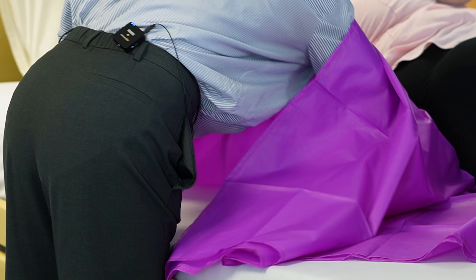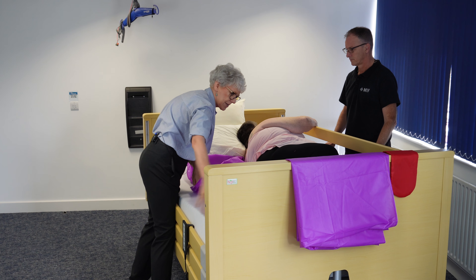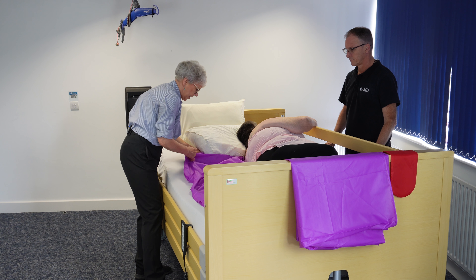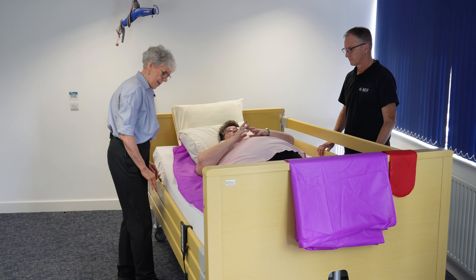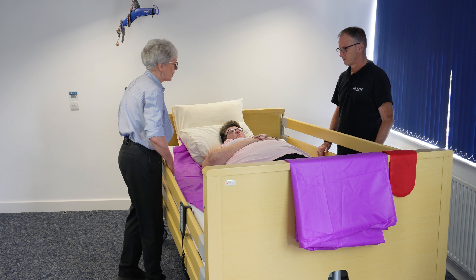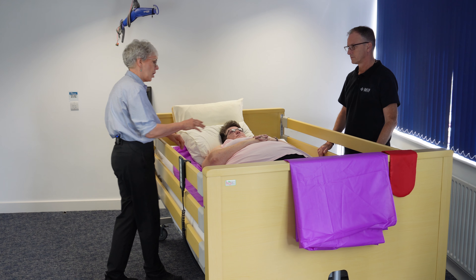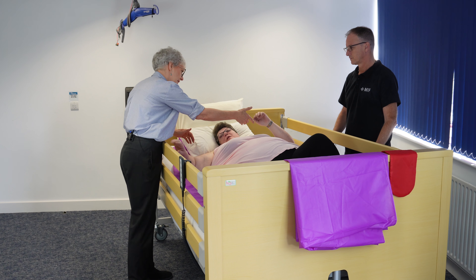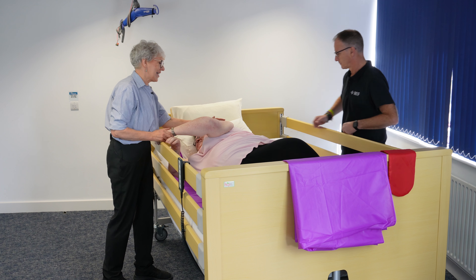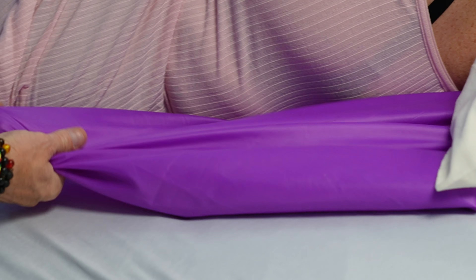I'm just going to come back down and under. I'll make sure that's smooth underneath. If you'd like to come back onto your back, Lou. At this point I'm going to ask Chris to uncurl — if I bring the bed rail up it just means that Lou's got something to hold on to, so if you'd like to come over and hold on to here. And Chris is just going to unroll on his side.